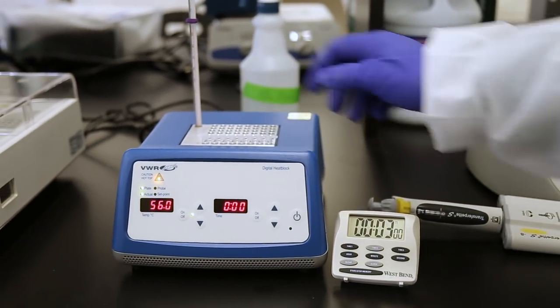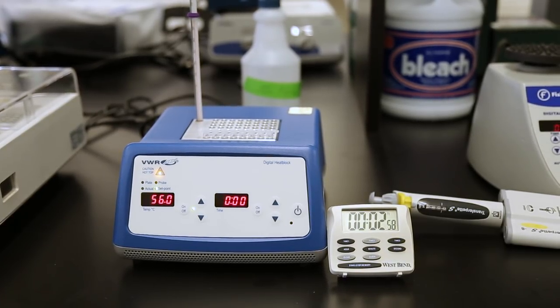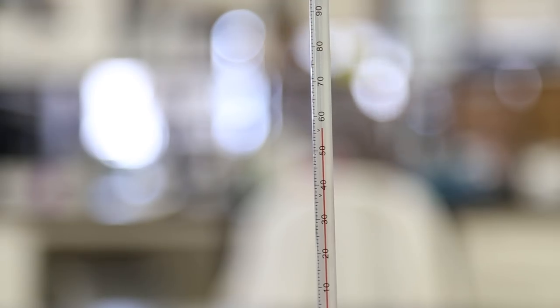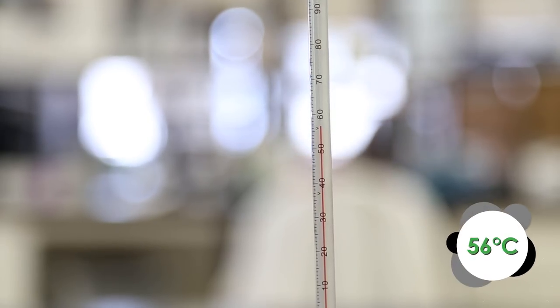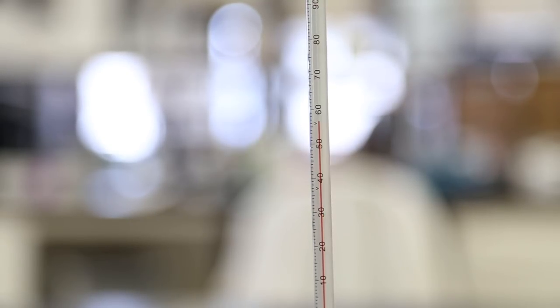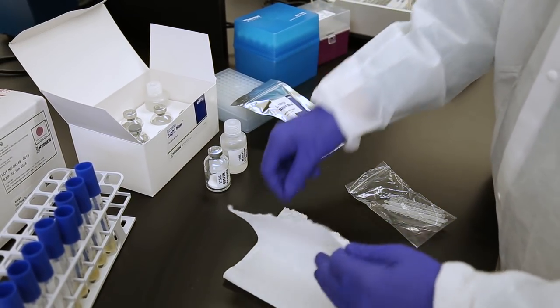Place them in the 56 degrees Celsius heat block and start a timer set for 3 minutes. Alternatively, you can use the answer reader as a heat block, but you must keep the lid closed as much as possible. The reaction tubes need to be heated at 56 degrees Celsius plus or minus 2 degrees for at least 3 minutes, but not longer than 5 minutes. Make sure the permanent caps you placed on the paper towel earlier are ready to go.